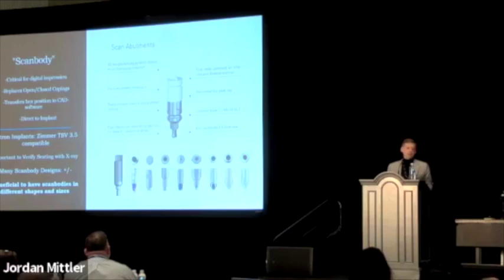There are different scan bodies that I feel more comfortable with in different areas. And obviously it's important, especially your first many times using a scan body, to verify seating with an X-ray just as you would with a coping, because if that's not seated, your final restoration is also not going to be seated.